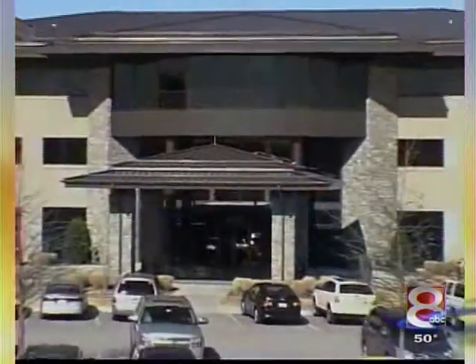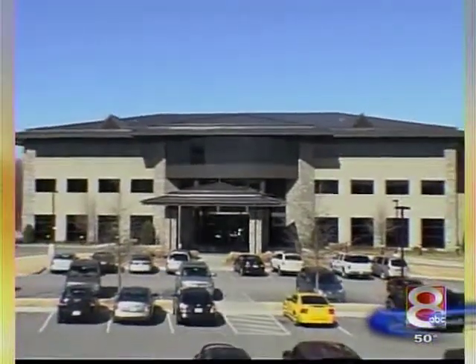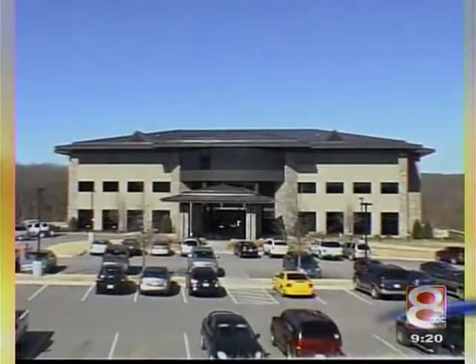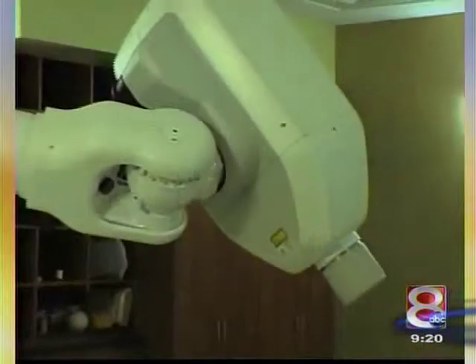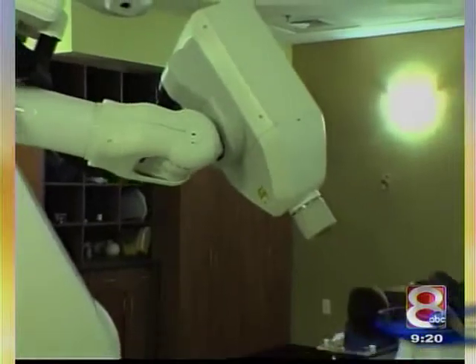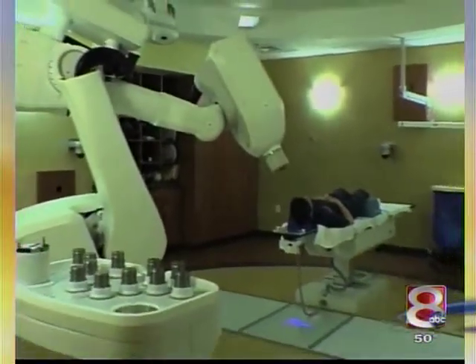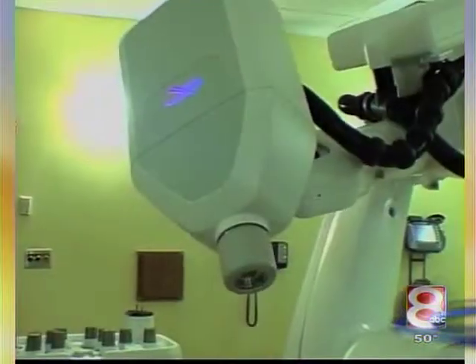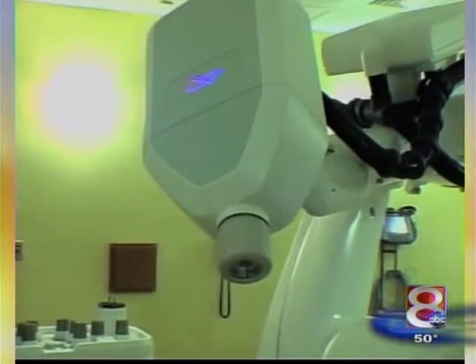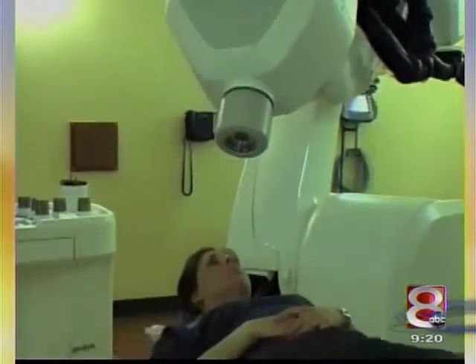Now, this is one of the more advanced and more powerful CyberKnives in the world, I understand, right? It's the first installation in the world of what's called the 8.0 unit, meaning that it has a higher energy source. It's able to deliver a very high dose of radiation in a shorter time frame than some of the earlier models. It also has an iris collimator, which is very similar to a camera, so you're able to adjust in real time the size of the beams that you're using to aim at a target, so you can be very conformal and also cut down the treatment time for patients.